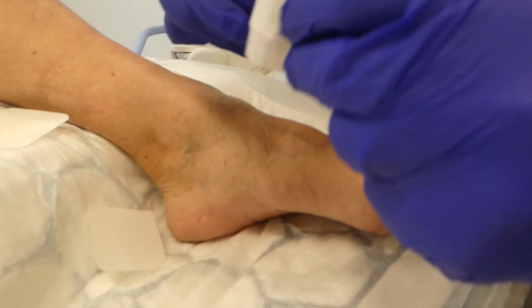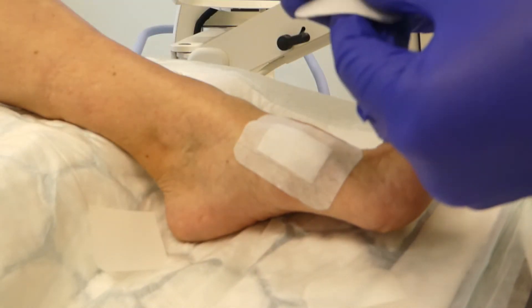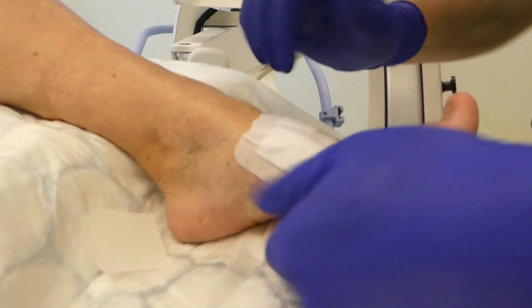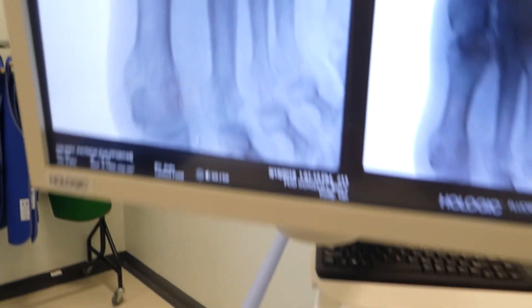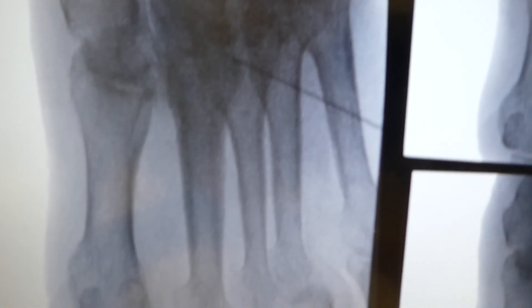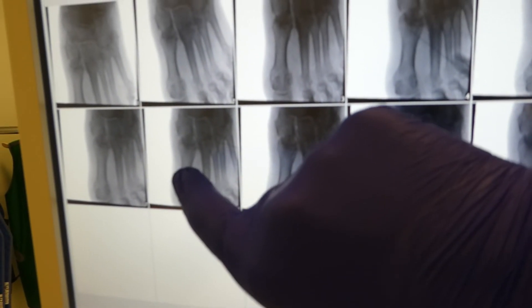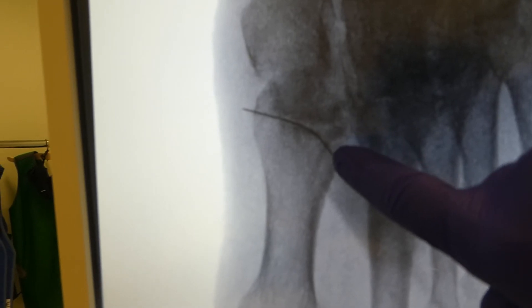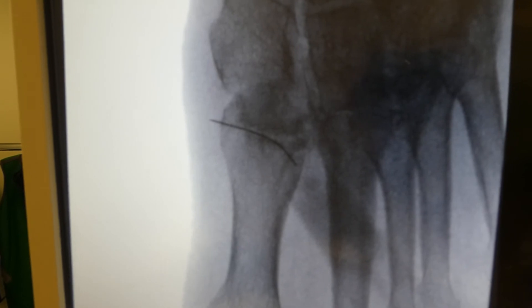On the top, don't forget we're very close to dorsalis pedis and the superficial peroneal nerve. Plasters — one on the top. Let me just remove this camera, sorry for the wobble. There's our needle placement for the second TMT. Let's just review: there was our first — the needle had come in all the way out, so we'd gone into the joint, came out all the way immediately, I just backed it back a bit and I was nicely in the joint.